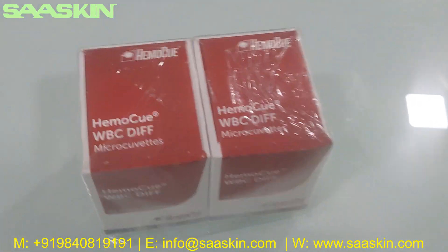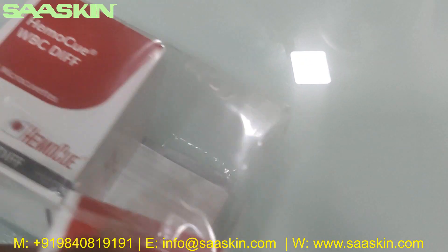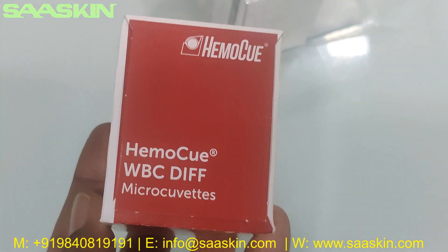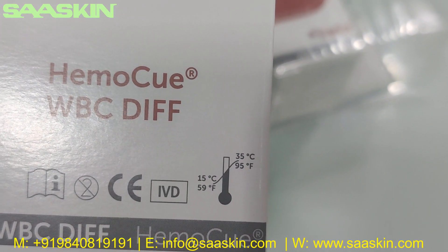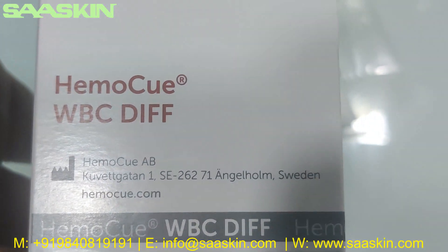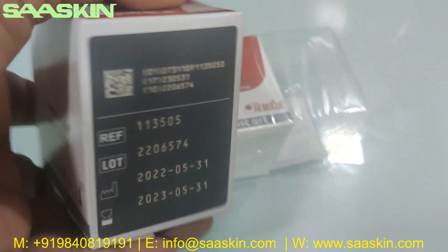The other side looks like this — this is the pack. Let me open this pack and we are going to take one box out and show you. This is the box — HEMO-Q WBC differential microcubets. This is the other side of the box. You can see it is CE-IVD certified. You can store it at a temperature between 15 to 35 degrees, which is room temperature. Each box contains 25 microcubets. This is manufactured in Sweden. On the other side, you get the reference number and lot number, and also the manufacturing and expiry date. This is how the standard box looks.